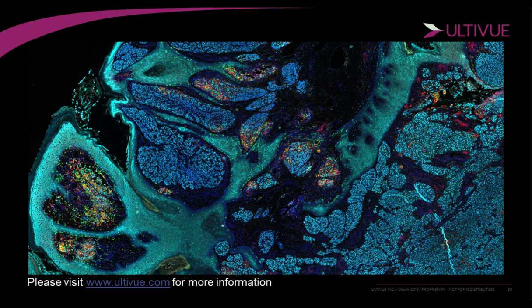Our exposures tend to be extremely low in the FITC channel and even the Cy5s, and across the board actually, so you're minimizing the amount of autofluorescence that will come up. So there is no need to go ahead and do autofluorescence removal. We've done staining of things like liver tissue, which tends to have very high autofluorescence, but the signal is so clear and so high that you do not worry about missing any positive cells.